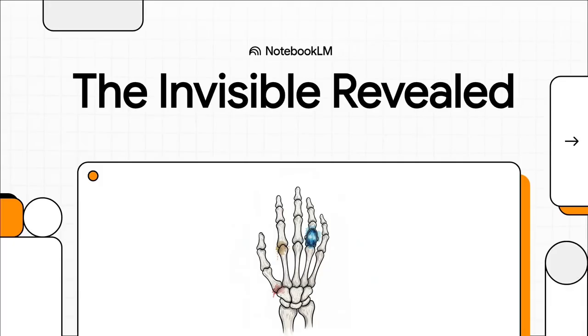All right, let's talk about a technology that literally sees right through us. We're going to peel back the layers on the story of how a mysterious invisible ray completely changed medicine and, yeah, became a totally normal part of your dental checkup.